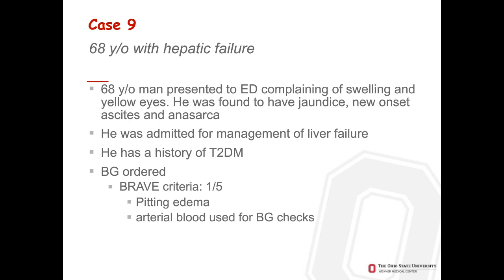Blood glucose checks were ordered. He was found to have 1 of the 5 BRAVE criteria, specifically pitting edema in all his extremities, so arterial blood was used for his glucose checks.